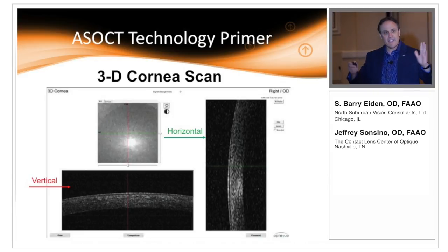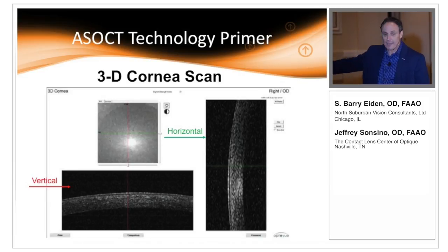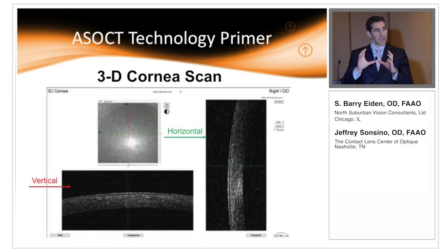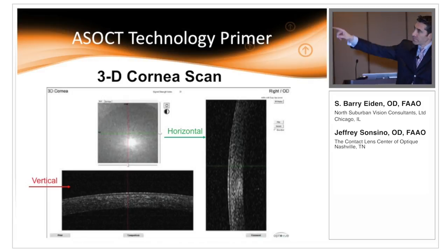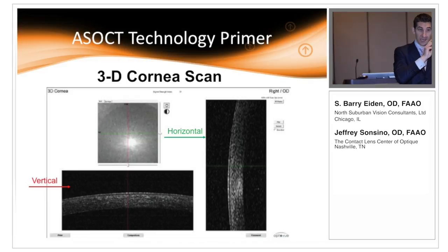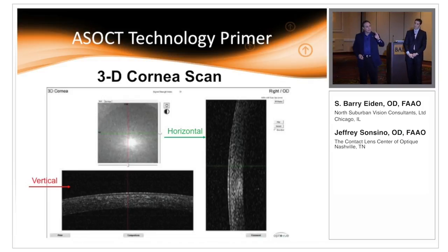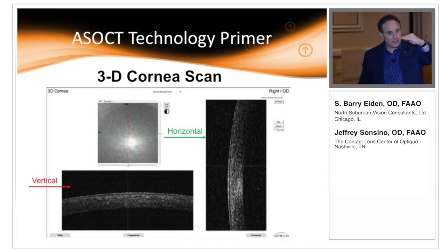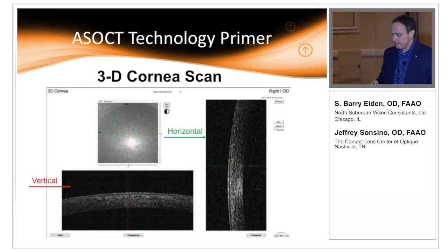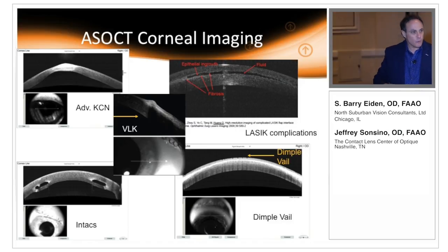A 3D scan gives us a chunk of the cornea. In an area of concern, I'm able to scan up and down — you'll see the vertical and horizontal as the line moves — and we can actually record videos as well. The key is: if you think there's a danger zone where the contact lens is bearing, you focus this 3D zone on that area. By manipulating the vertical red line and horizontal green line you can focus exactly on the area in two dimensions. For example, in one case we were suspicious of a zone of bearing, and as we moved down along that 3D zone, the vault was decreasing to the point where the lens actually came into contact.